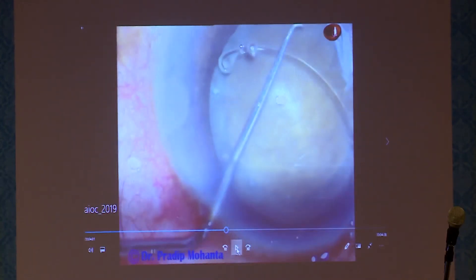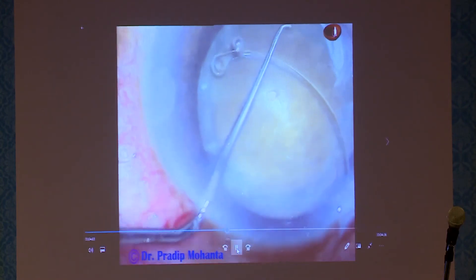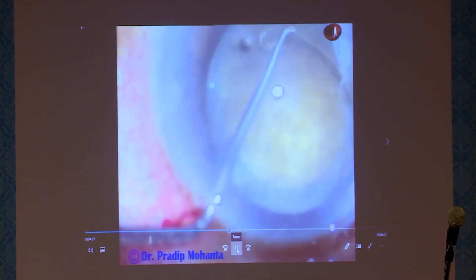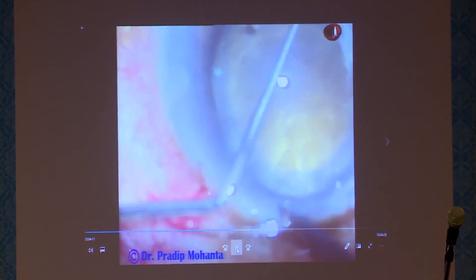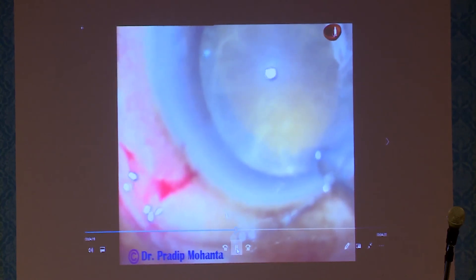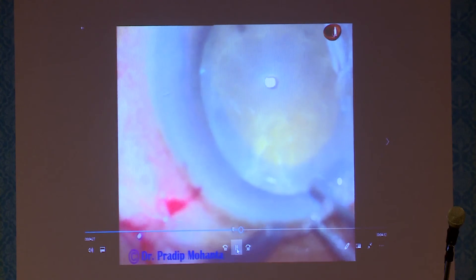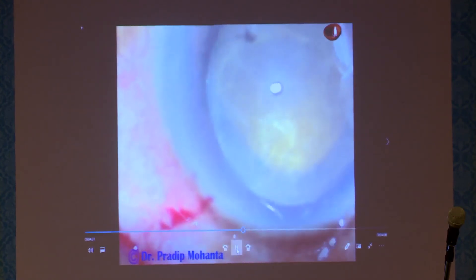Here is another trick on how to place the CTR under the anterior capsular margin. Use a Szynski hook through the side port; place the Szynski hook over the CTR and place the end of the hook under the anterior capsular margin, then push it. Your CTR then has no other option but to go under the anterior capsular margin. Once you are sure it has gone under the margin, introduce the CTR fully.